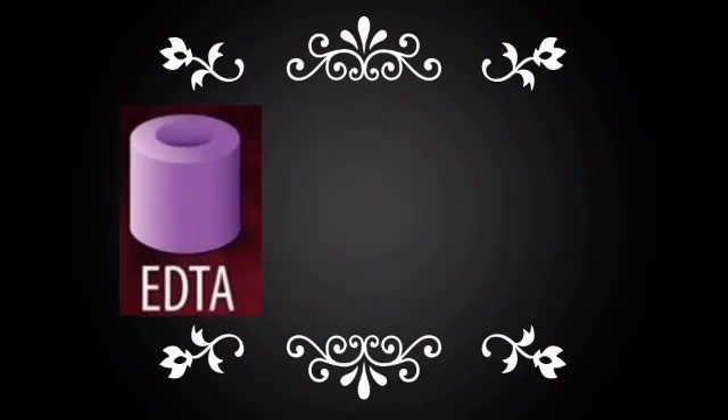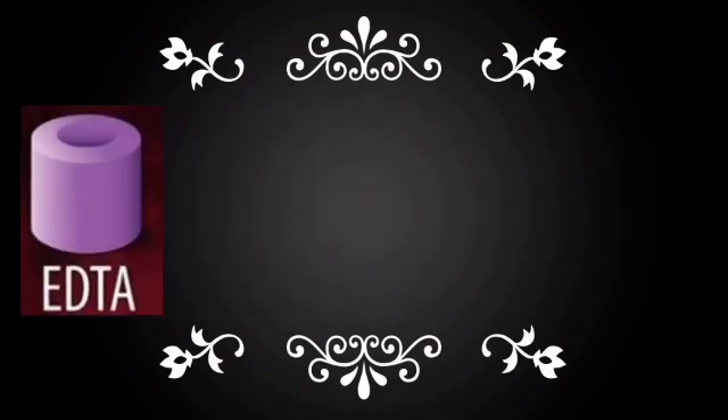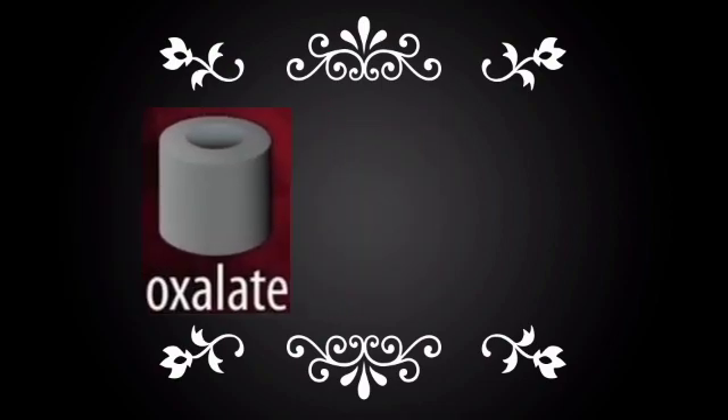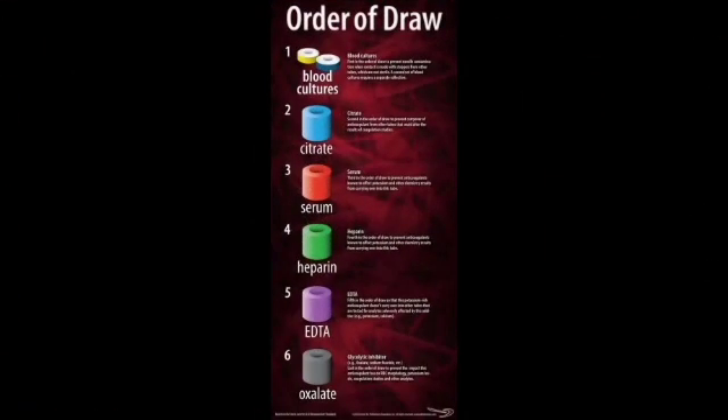Next is the EDTA tube with a purple color cap, and finally a fluoride tube with a gray color cap. This is the specific sequence which should be followed during each blood collection.